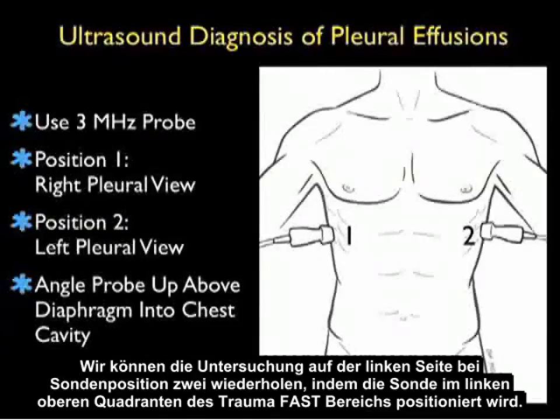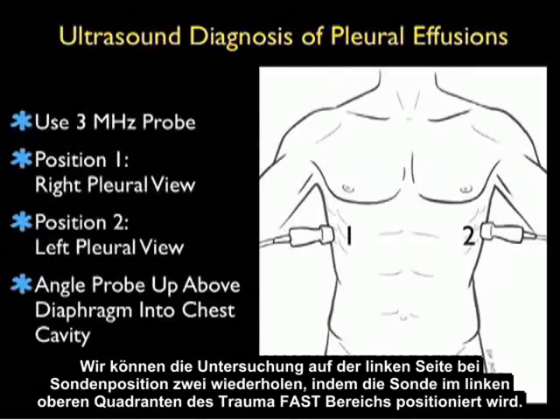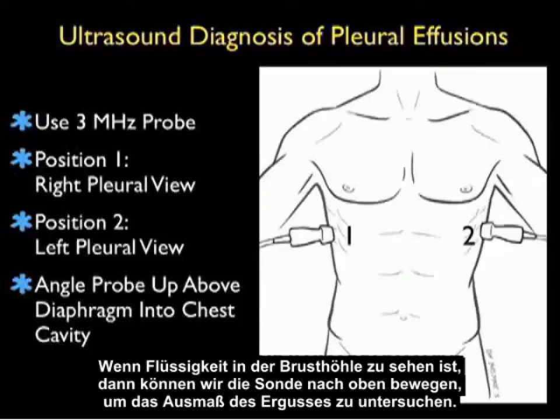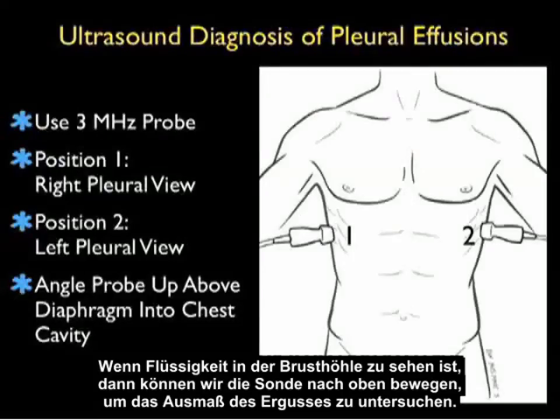We can repeat the exam on the left side as shown in probe position 2, placing the probe into the left upper quadrant trauma fast view. Look first into the area above the spleen and below the diaphragm, and then angle the probe upwards into the left thoracic cavity. If fluid is seen within the thoracic cavity, we can then move the probe upwards to investigate the extent of the effusion.